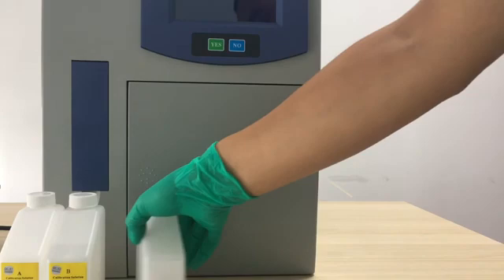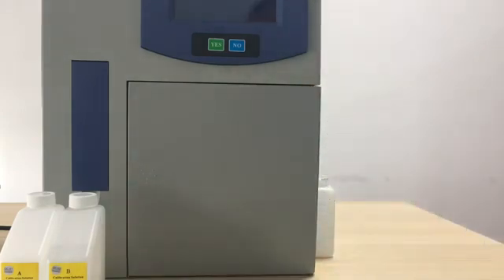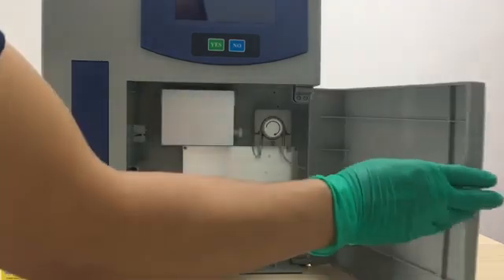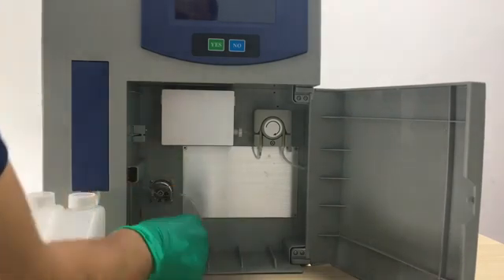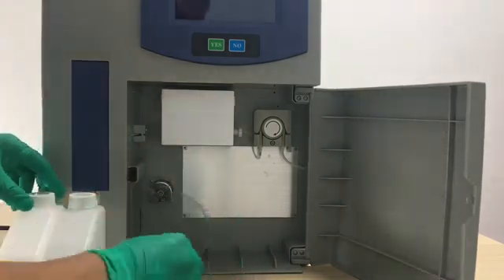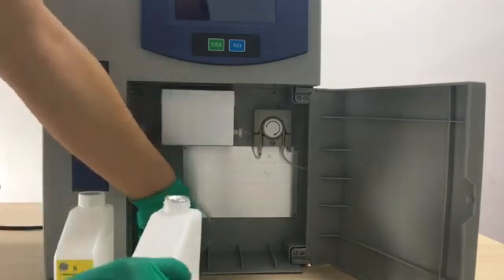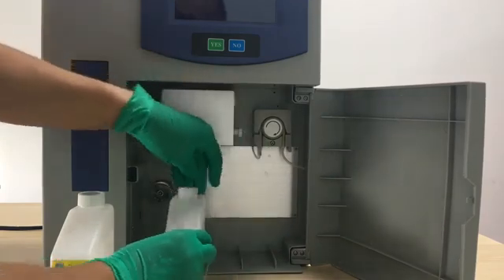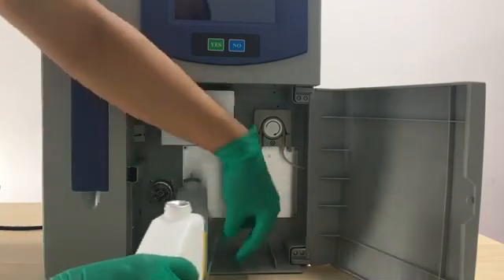Now we put the waste bottle outside of the machine and put the tube into it. Then we can open the door and place reagent calibration A and B in the right position. We need to pay attention: A is at the downside of the distribution valve, and B is on the right side.